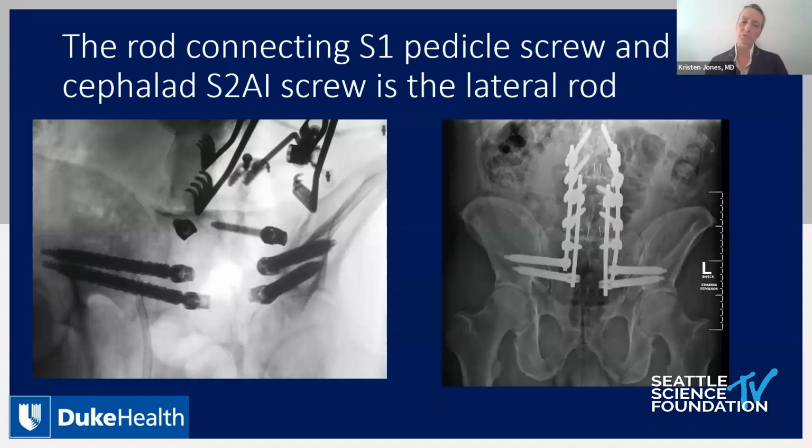And so we talked very briefly about this. The S1 pedicle screw gets connected to the cephalad-most S2AI screw, and then I run a rod medially from the caudal screw up to a dual-headed pedicle screw higher up in the construct.